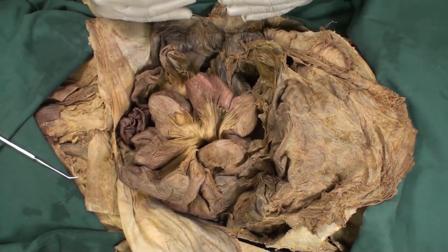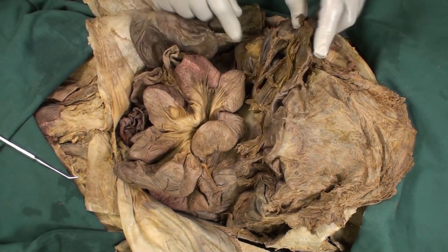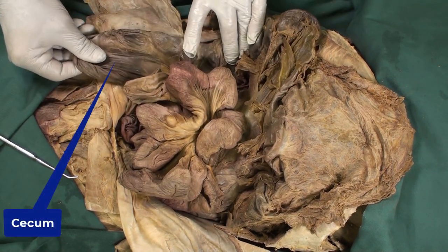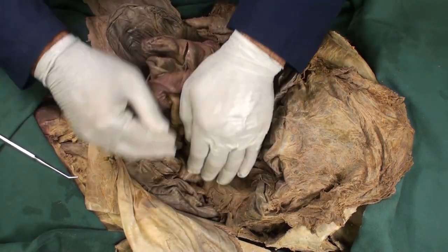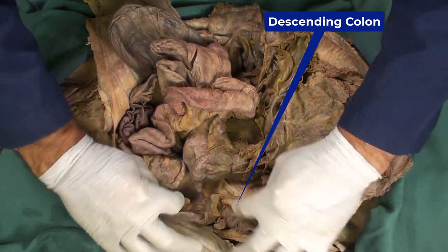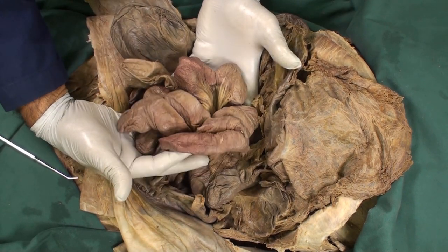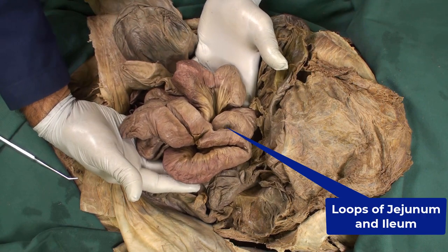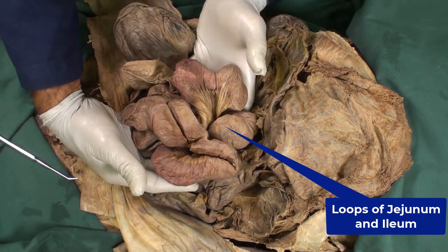Coming to the right-hand side and looking at the transverse colon, we can follow it all the way to the right and down to find the cecum. I'm going to pull the cecum down. On the left-hand side, the descending colon is located there. What we have in the middle is the loops of small intestine — the jejunum and ileum — framed by the large intestine.